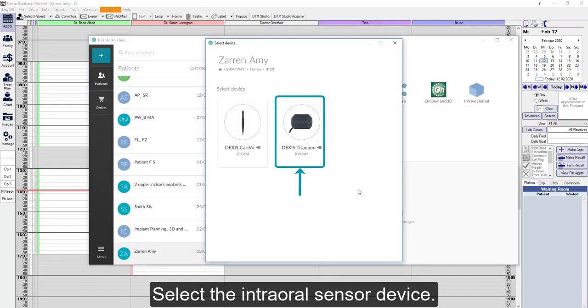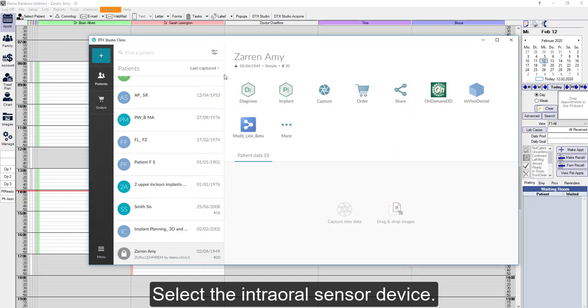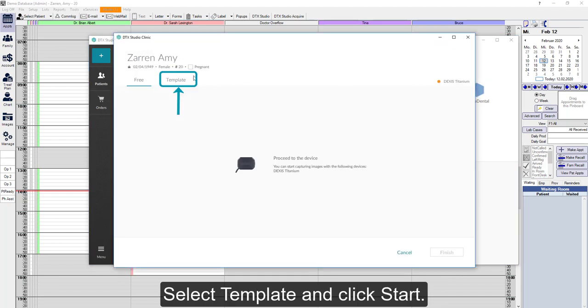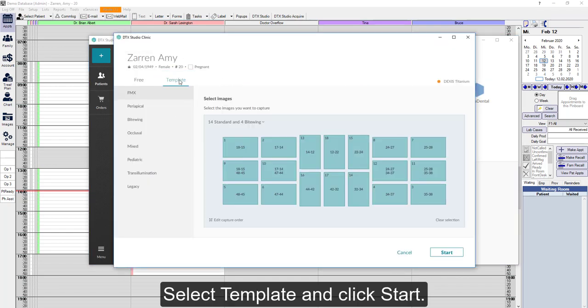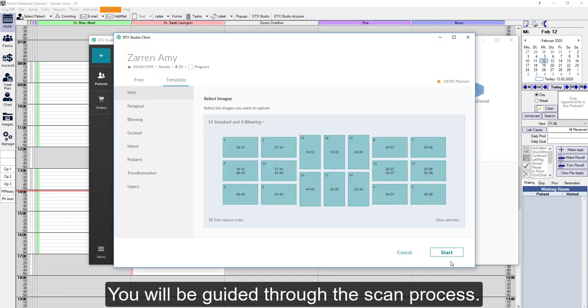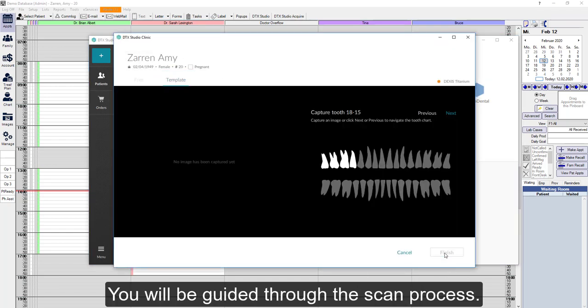We'll select the intraoral sensor device. Then we'll select Template and click Start. The software will guide you through the scan process.